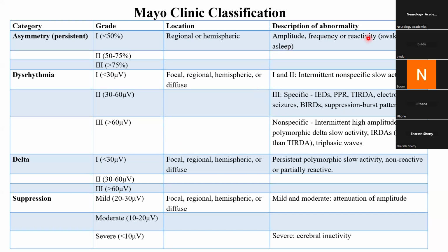Rejection is differential, when the activity is present. The difference between the two electrodes is what is being portrayed in the montage we are using. So it rejects, or the projection of the difference is what they see. The common amplitude is being rejected. Okay. So whatever you said is right, but you can be more precise. So you have an input one and input two, that is one electrode and the second electrode. And this is exactly what I told earlier.